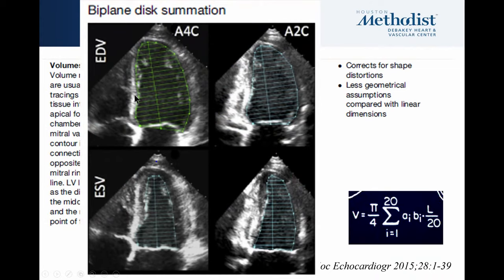In this example, the apex in the two-chamber view is also pointing toward the transducer — so these were very well acquired. If you're going to do biplane, you need to make sure both four-chamber and two-chamber are properly done; otherwise you could have errors. Also notice the way the tracing is made: it excludes trabeculations within the cavity. We learned this two ways — first from contrast, which expanded the whole cavity and showed that traditional tracings including trabeculations created smaller chambers than in reality; and second from comparisons with MRI.